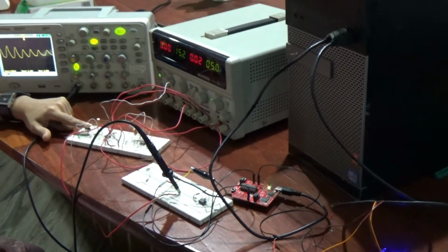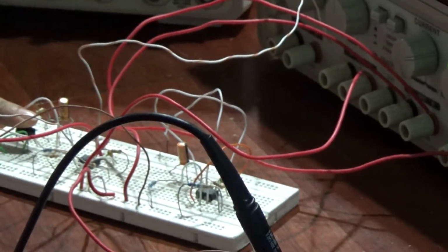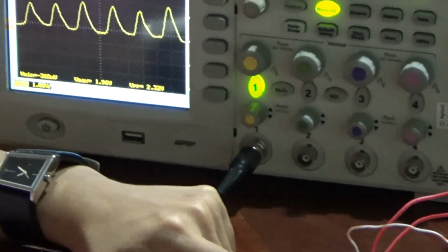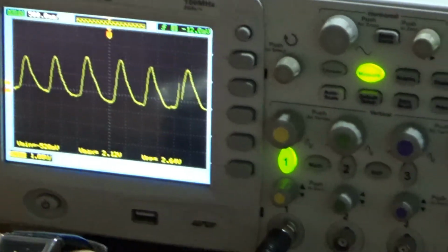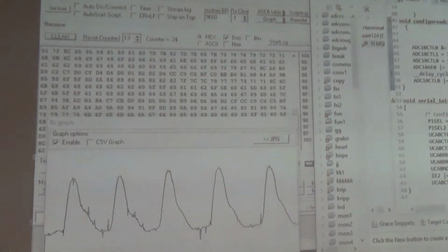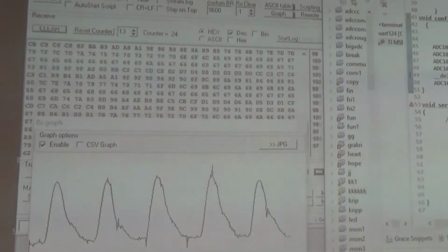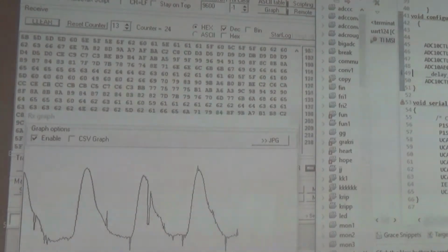This circuit design is for measuring blood pressure, pulse rate and blood glucose. It includes the sensor data processing where amplification and filtering is performed. A finger is placed on the sensor and the output data is displayed on the oscilloscope. This data is sent to the MSP430 microcontroller for further processing. Now you can see the ADC conversion in Code Composer Studio, which is the IDE we have used for coding. The ADC converted data is then sent to a UART terminal.